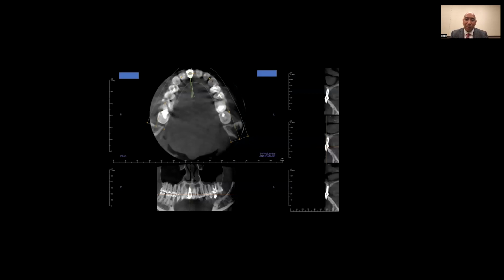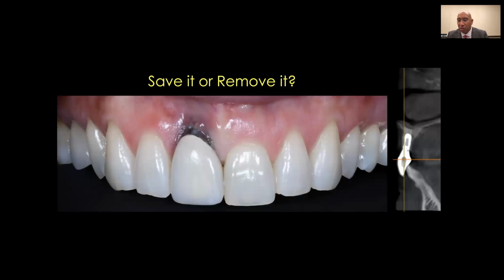But when you look at her CBCT, look at that sagittal view on the right side. That implant occupies the majority of her alveolar process there. I don't know that you want to be trying to remove that implant. Here's a closer look at it. Yeah, there's a facial plate on the facial and lingual aspect. So it's not like she's got a blown out facial plate or something. She literally just has very thin bone and thin tissue.